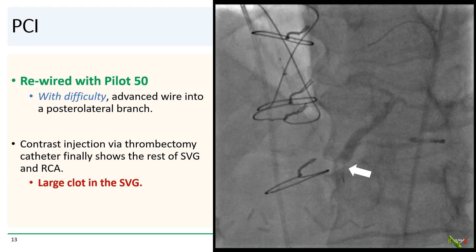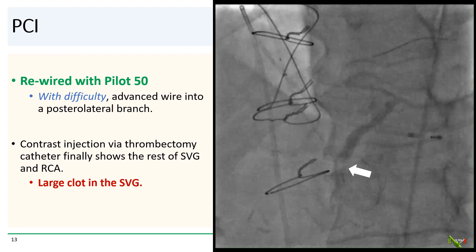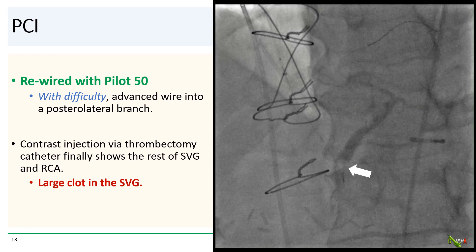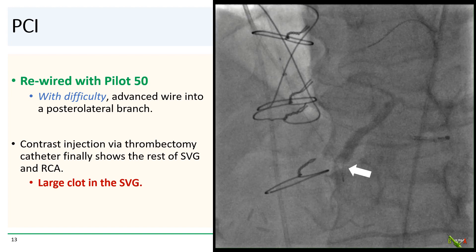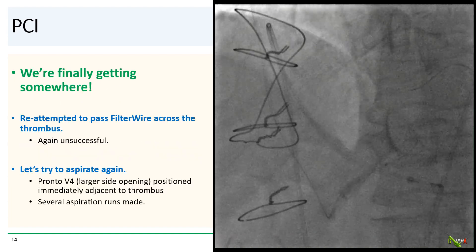We rewired with a more hydrophilic wire. With great difficulty, we eventually maneuvered a Pilot 50 wire down the vein graft into what appears to be a right posterolateral branch. Contrast injection via a new thrombectomy catheter now finally shows the rest of the SVG as well as the distal RCA territory. We can now see a very large clot in the SVG — indicated by the white arrow — that seems to be causing the problem. This is good news: we can finally see what we're dealing with.